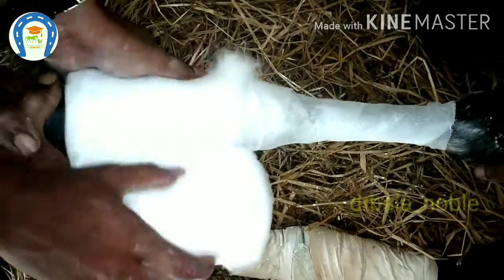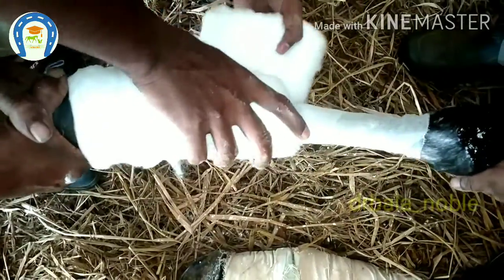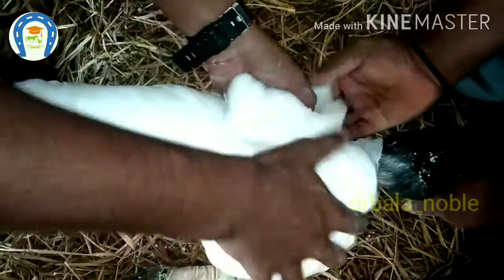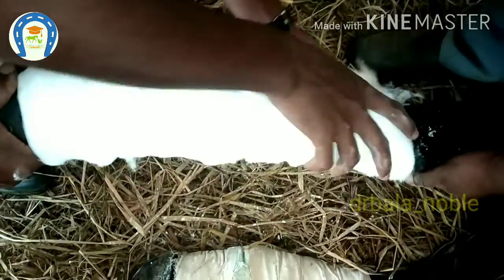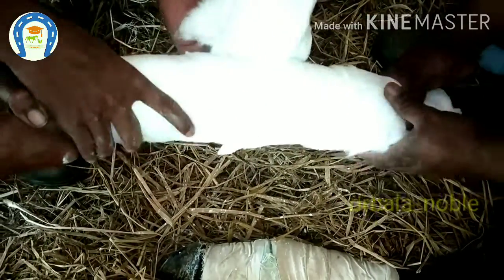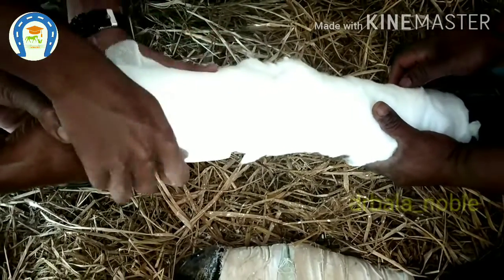Next is the application of cotton. We have to apply the cotton evenly so the pressure will also be even. The cotton should be placed a little above and below the splint edges, because the edges are more dangerous — to avoid injuries, we should apply more cotton on both edges.